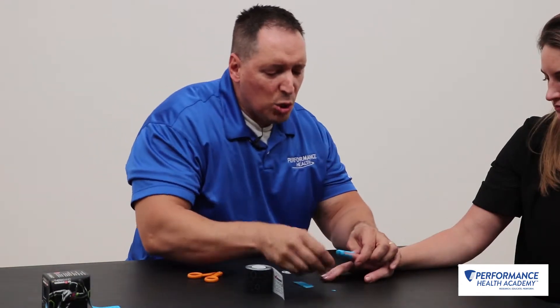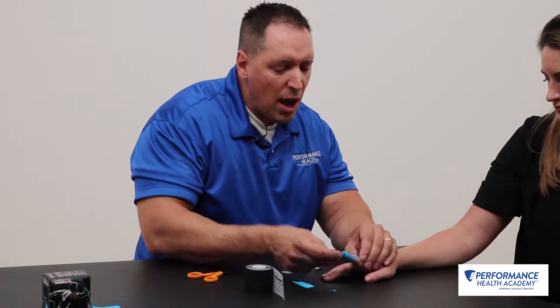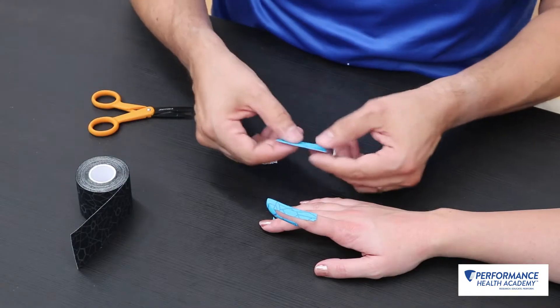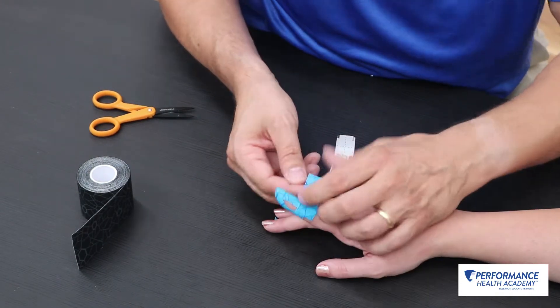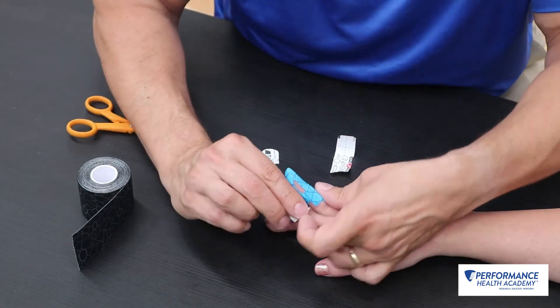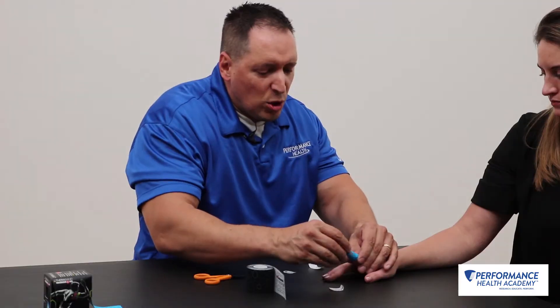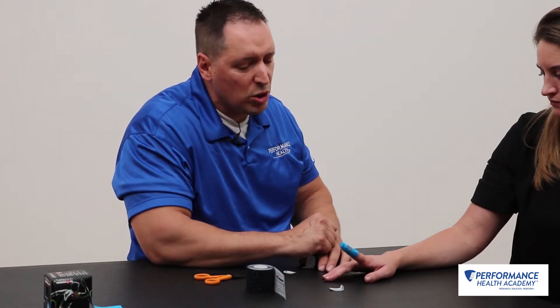That'll assist with retraining when you're coming out of the mallet finger orthosis at maybe 8 to 10 weeks. You can also put a non-therapeutic piece of tape around the middle phalanx, wrapping that around and ending back on the first piece of tape. That gives a little extra assist to maintain DIP joint extension while still functioning throughout the day.